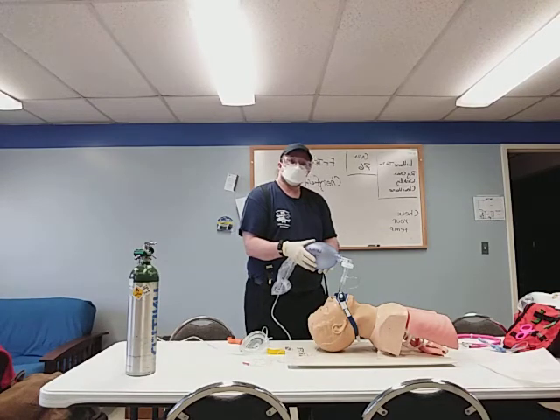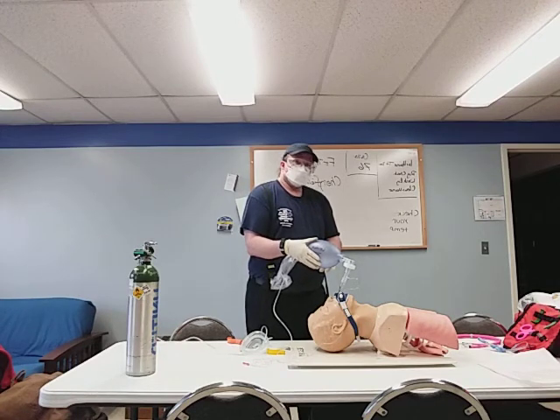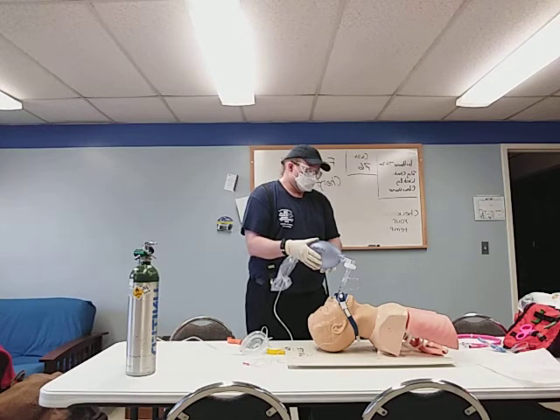The examiner asked me how I will know if I'm getting adequate volume on each breath. On ventilation, I will look for chest rise, which I see.